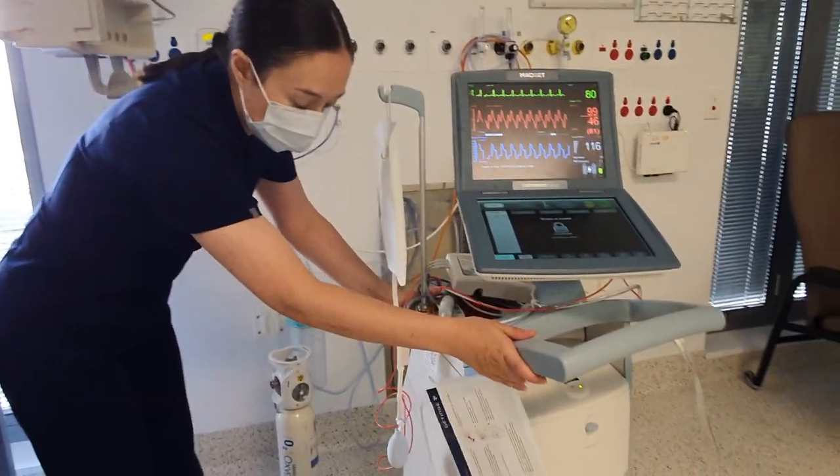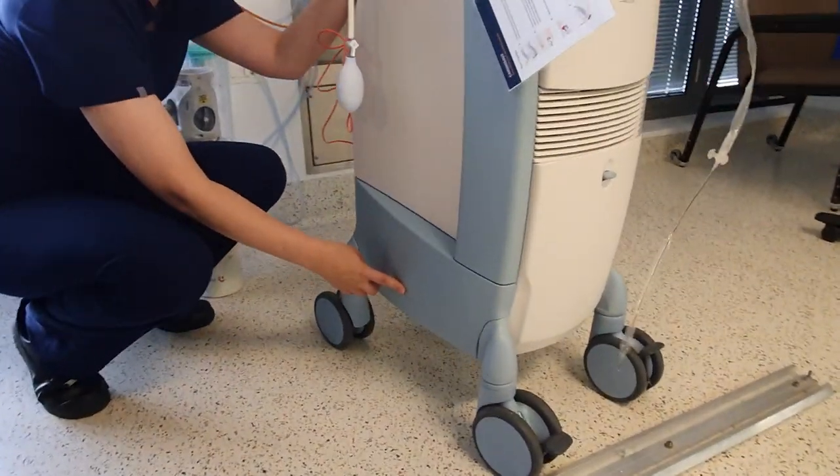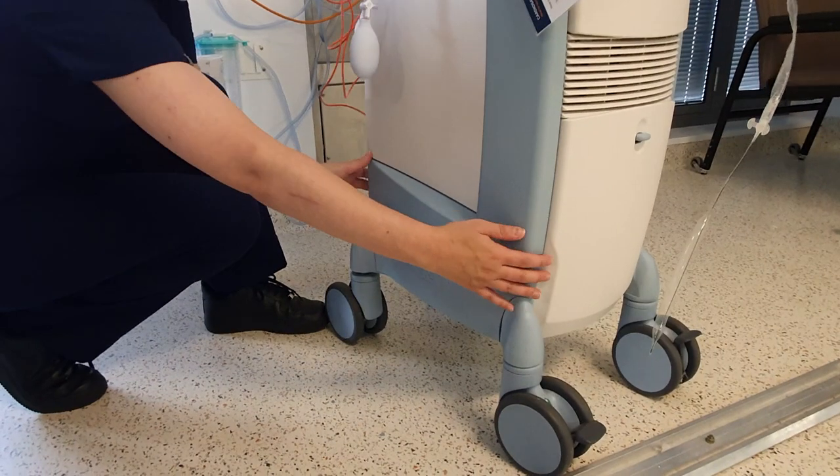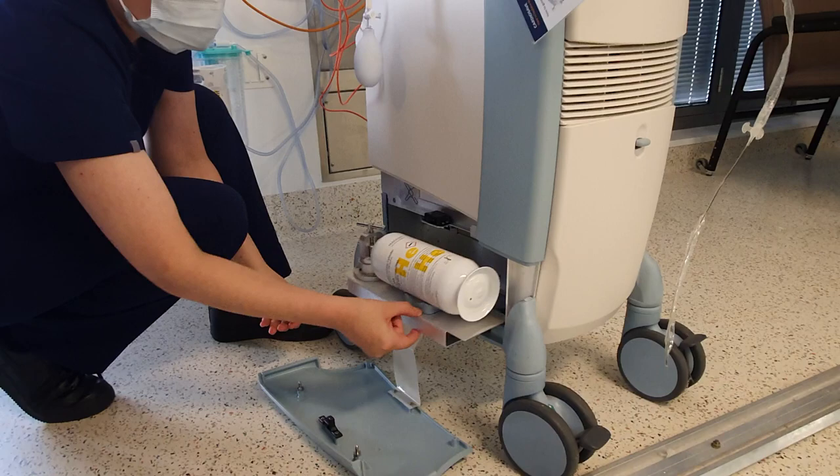The helium tank is located on the side here. You'll have a picture of a helium tank and a label written there. This part is designed to come off, so you take this off and you slide out your helium tank.